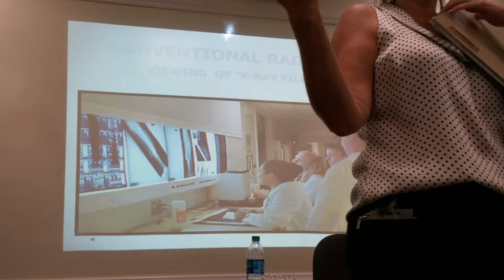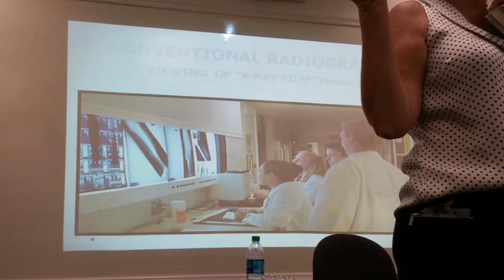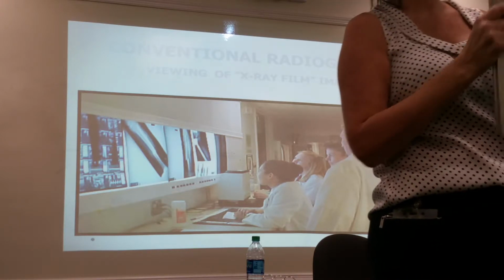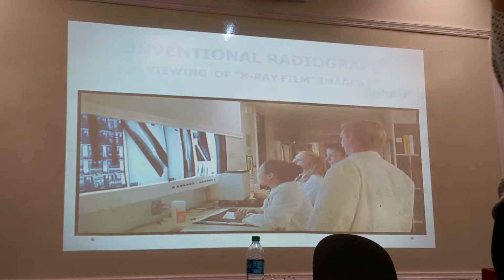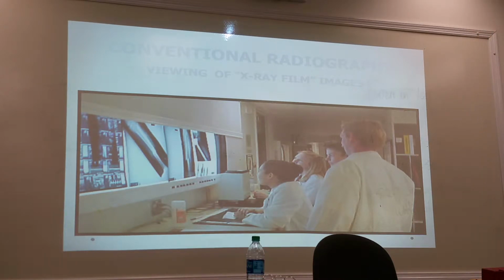One time, we were on the night shift working ER, lots of things going on, and the water got turned off. I mean, you have no image until you have a processor that can process it, and it requires water and electricity. So lots of problems with this, but it was great in terms of reducing patient exposure. And there's all different kinds of cassettes and manufacturers. This is actually Gavert, never heard of them until I moved out here to California. DuPont I'm used to, Kodak. So again, these are gone. And so now we are here.